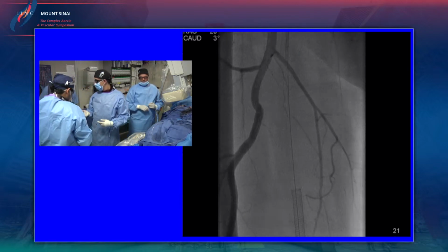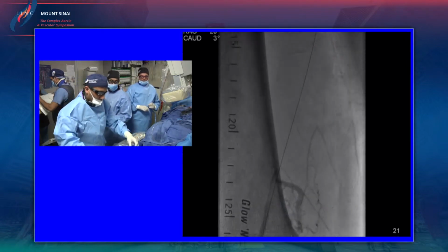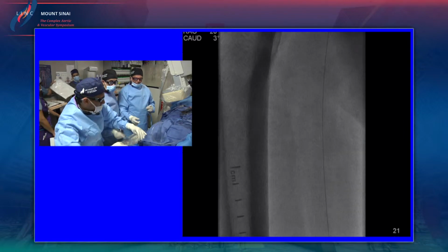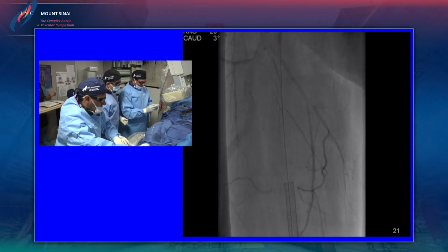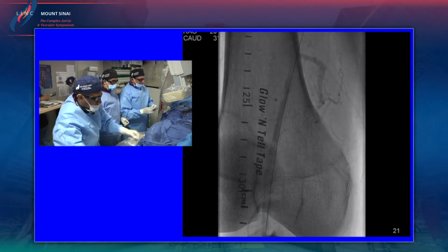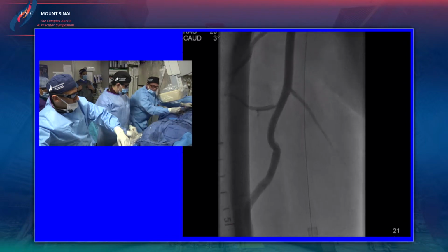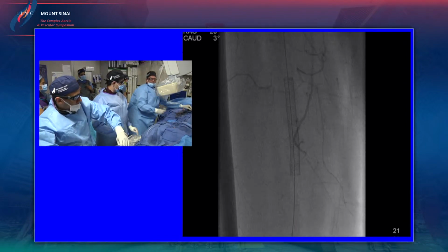I'm certain that we're probably going to end up embolizing a little bit more. And then at that stage, if we have to aspirate, we will. But I think that's part of the idea of predicting what's happening through the available imaging modalities that we have here. So as you know, the stent, I mean, we're eager to see what the Imperial trial shows. But clearly at this stage, having a drug-eluting stent is definitely advantageous to us.